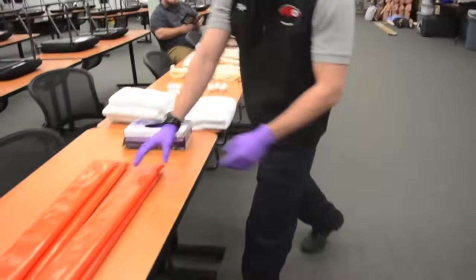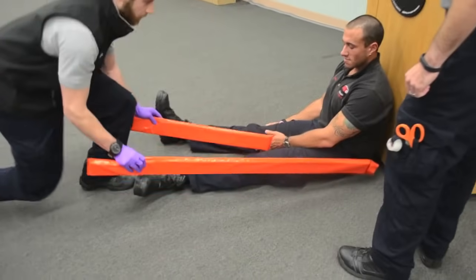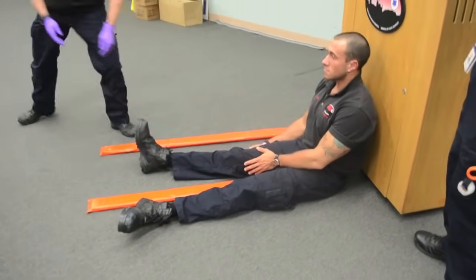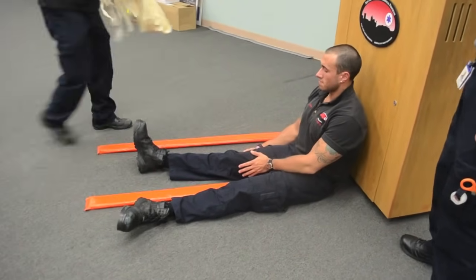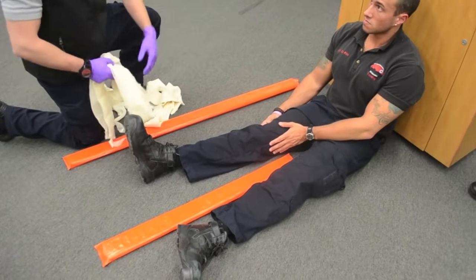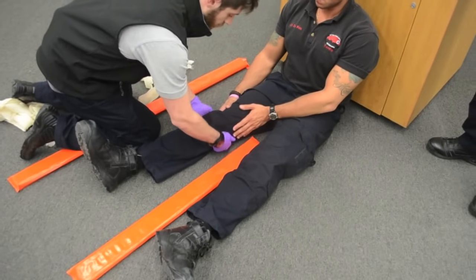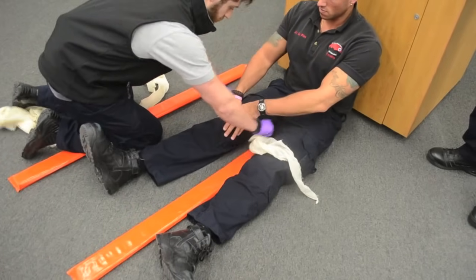I am going to get my padded board splints. Measure on the unaffected extremity and just put those in place for right now. I am going to take my cravats and put two above the knee and two below the knee, making sure not to cover the joint. I am going to use the space underneath the knee as a natural void to help slide these into place.